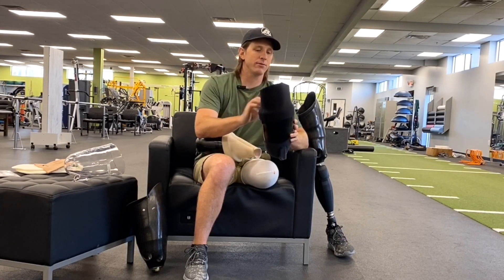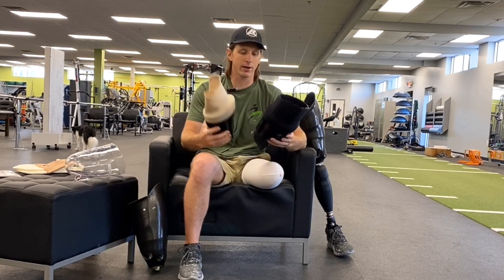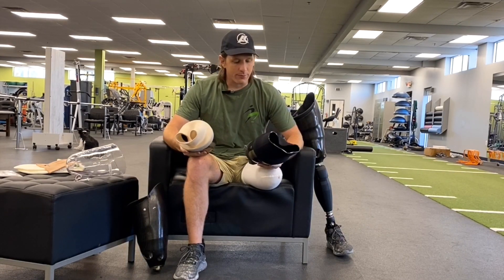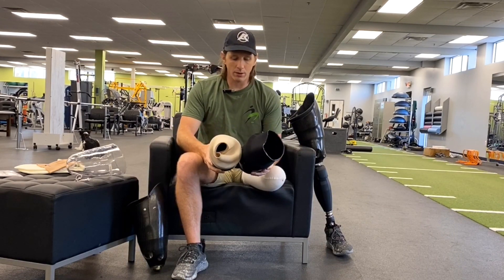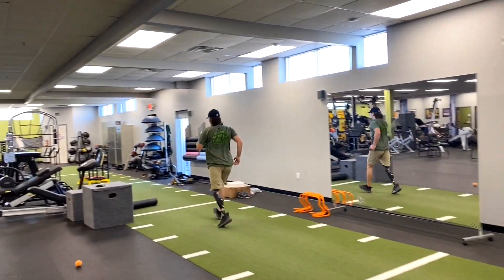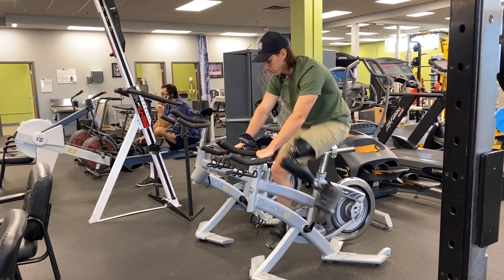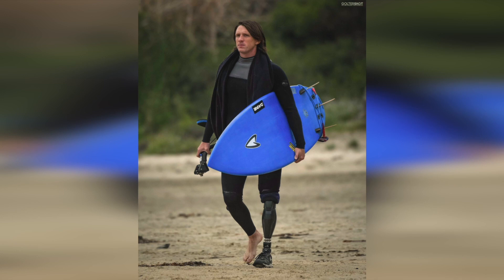I can't feel the upper trim line as much with the flexible inner, as the top trim line can kind of flare out while wearing it. I've been in the double wall for about five years now and I'm really happy with it. There's nothing this socket can't do — from walking to running to surfing, any activity. As an amputee, it allows me to live life to the fullest, and there's nothing more I could ask for.